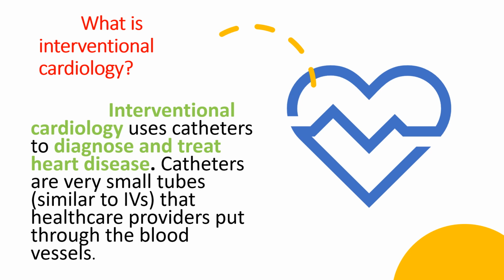So what is interventional cardiology? Interventional cardiology uses catheters, that is coronary catheters, to diagnose or treat heart disease. Treatment means percutaneous transluminal coronary angioplasty.